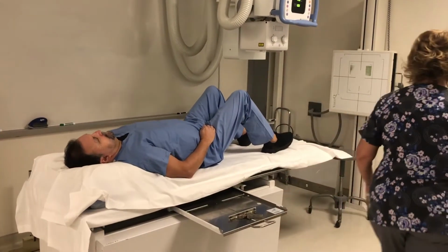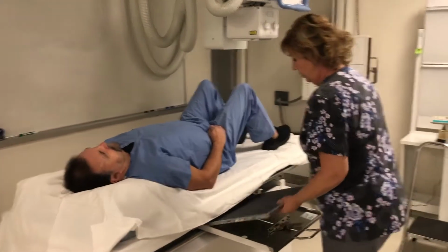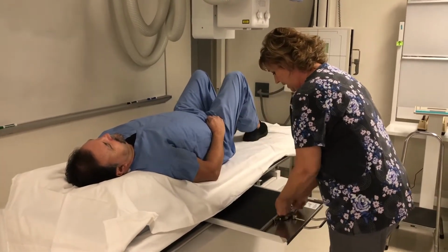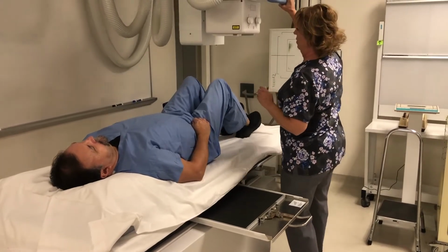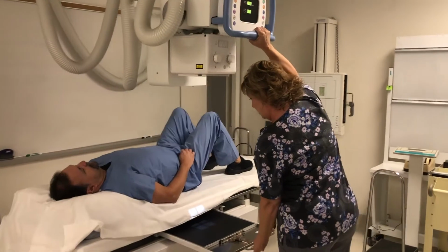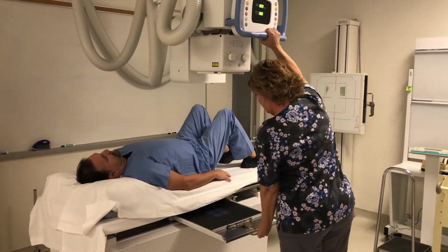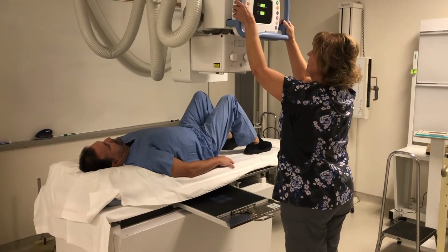We'll be doing AP first. So take a 14 by 17. And I'll be collimating to 7 by 17, at 40-inch SID.